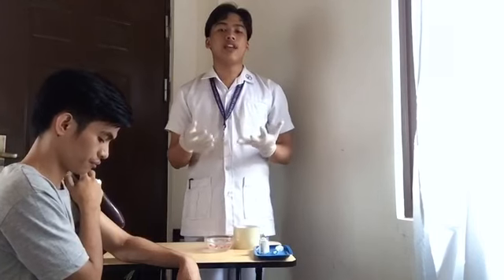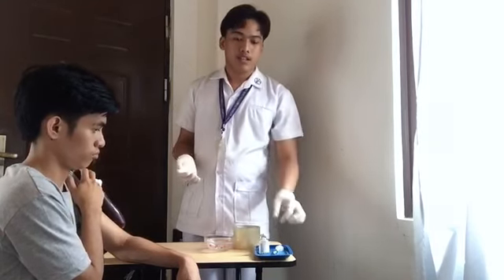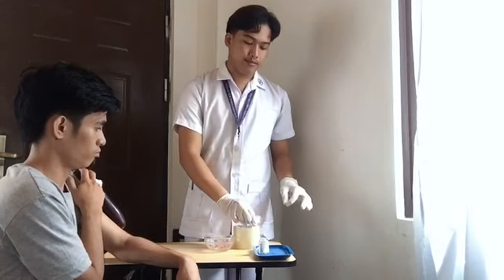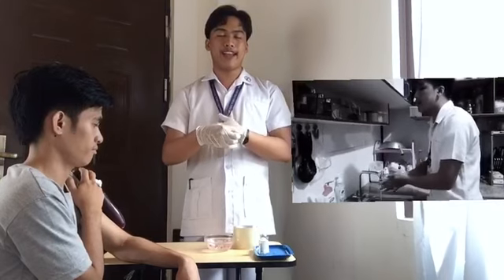Next is activate the needle safety device or discard the uncapped needle and attach syringe into the proper receptacle. So I am going to uncap the needle and discard this. Next is remove gloves and perform hand hygiene.